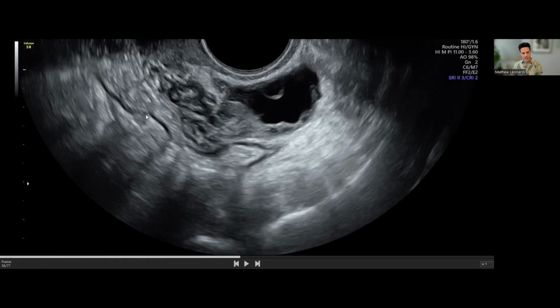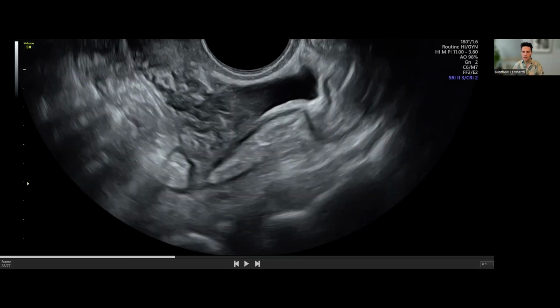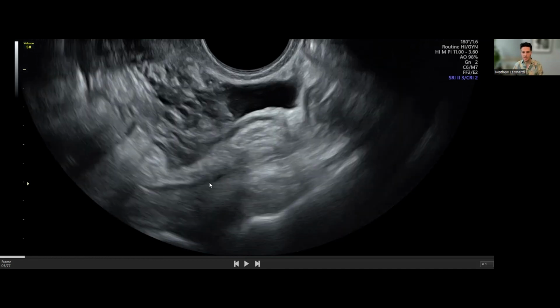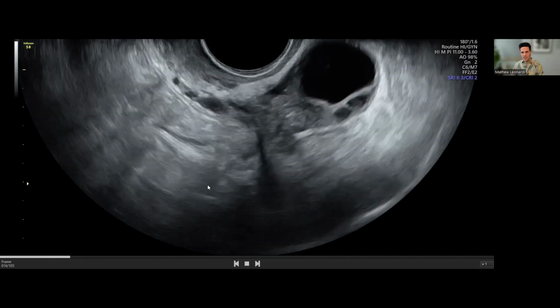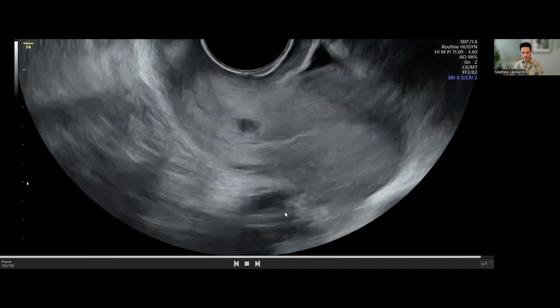And then we're starting to see it even on this area here on the left side of the screen. And this is actually coming on the anterior side of the uterus because this uterus is retroverted. And actually with a retroverted uterus, sometimes not a lot of the bowel is sitting in the pouch because the fundus of the uterus essentially holds it out of the pelvis. It kind of closes the space a little bit.